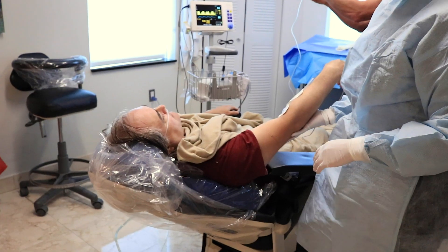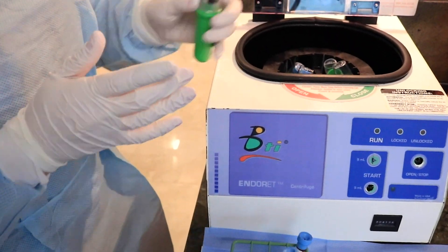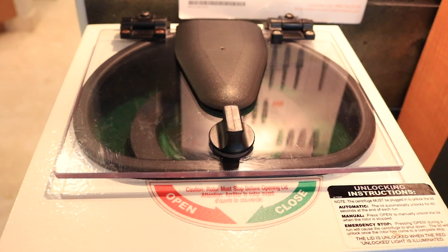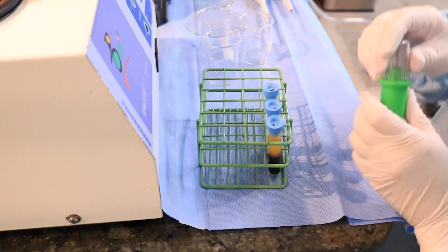Step one is to collect a small quantity of the patient's blood. The collection tubes are transferred to the centrifuge machine. At the end of the cycle, the collection tubes are immediately returned to their stand. It is important that this is done carefully with minimal disruption to the blood.